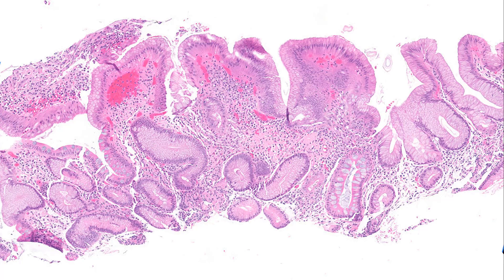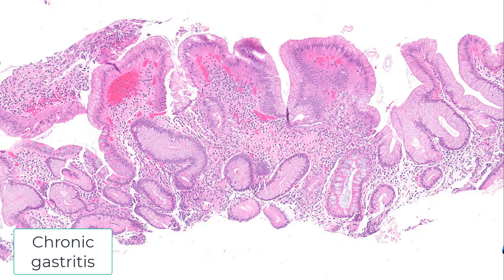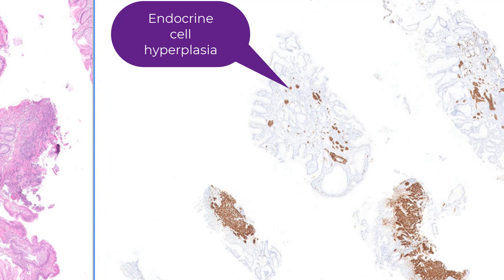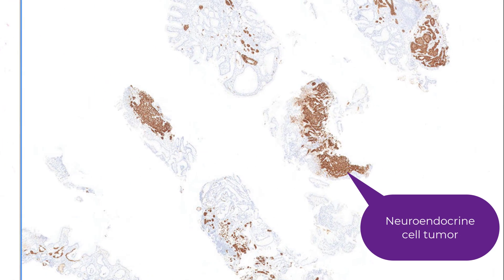Unfortunately, this endoscopist was clearly not my friend and did not provide me with a biopsy from the gastric antrum. But let's see what I can do here. This is gastric body fundic mucosa. There's chronic gastritis, there's atrophy with complete loss of parietal cells, and there's intestinal metaplasia. When I look at a chromogranin stain, not only is there endocrine cell hyperplasia as seen in this fragment, but there's also a wider mass of chromogranin-positive cells. This is a neuroendocrine tumor.